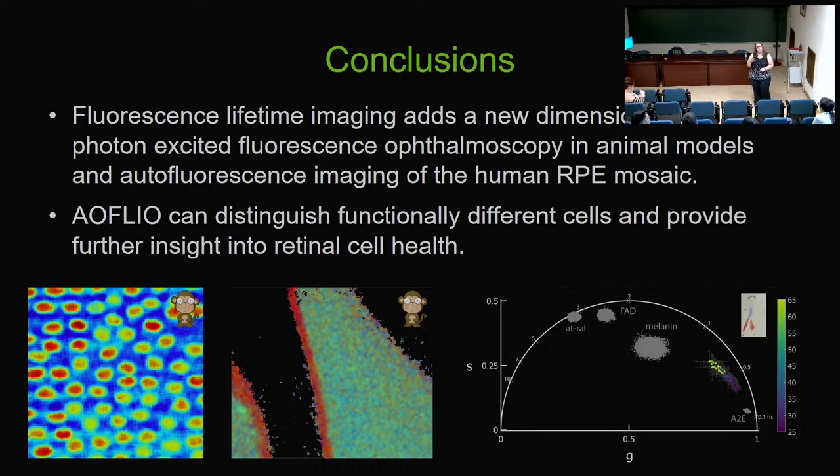The change in the pulse repetition frequency is not providing the x-axis in this phasor plot. It's the sine and cosine components from the discrete Fourier transform. We evaluate it at one frequency. It's because it's one data point, right? You do the Fourier transform, you select one data point. You can select different orders and create different phasor plots, but you only get one for each repetition. For that repetition frequency, you only get 1 point for each.